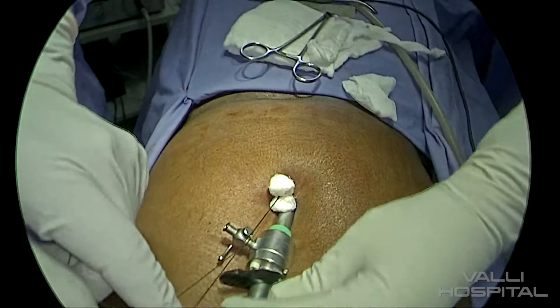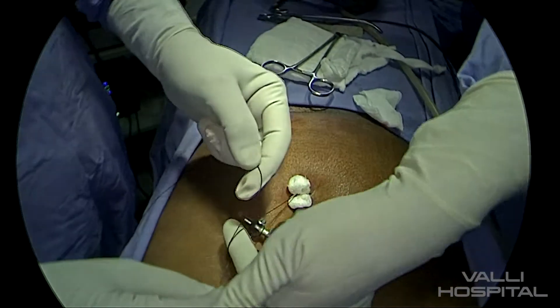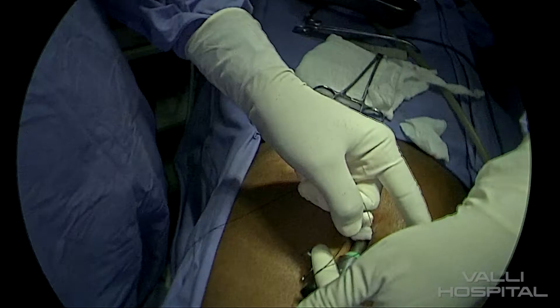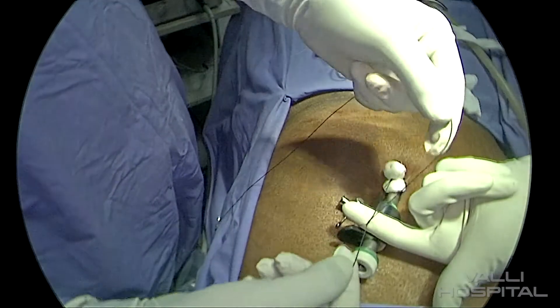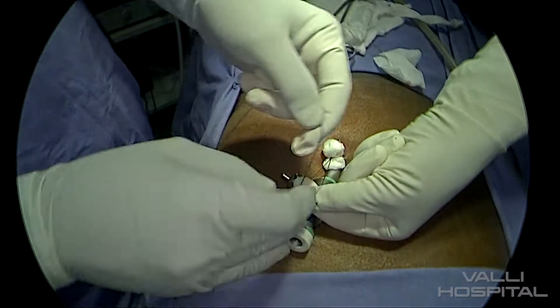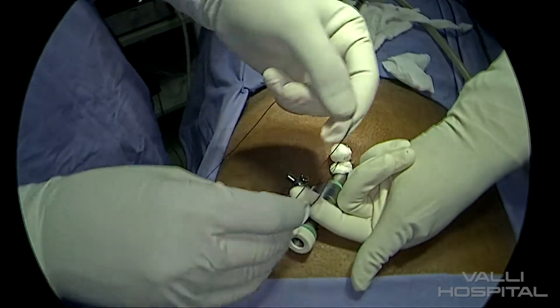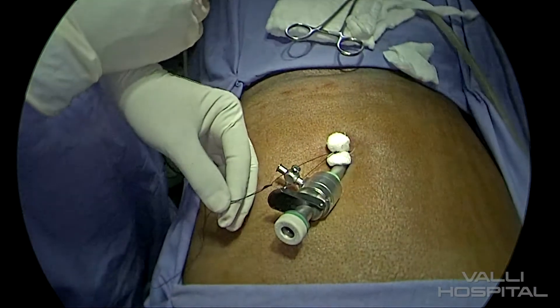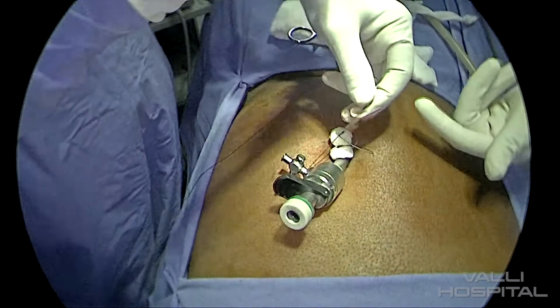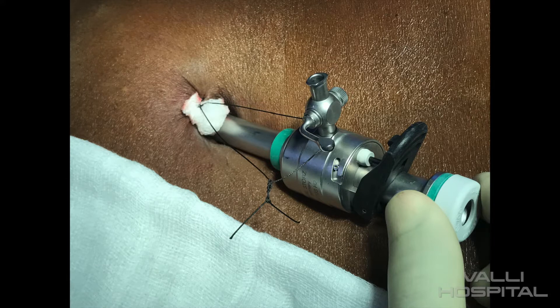Then you have to tie it around the side channel. You have to leave a little bit of gap so that there is play, so that the trocar will go in and come out. When you are removing the scope, the trocar will come out — to avoid that, you have to tie it to the side channel. It has to look like this at the end.